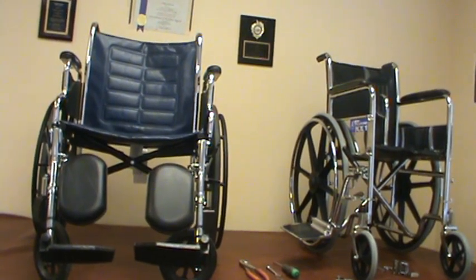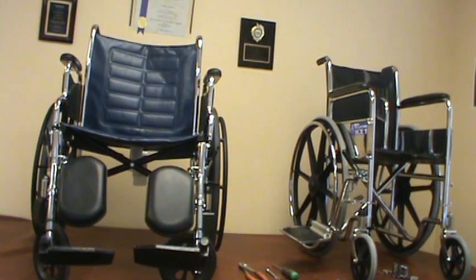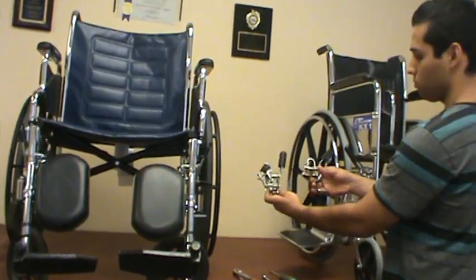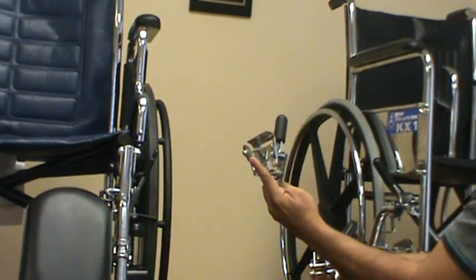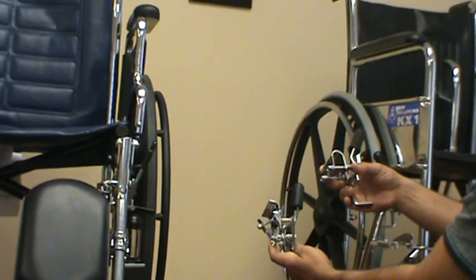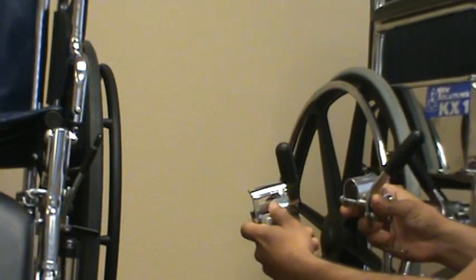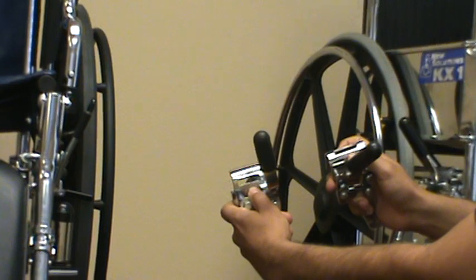This video will show you how to install and adjust wheel locks on a standard manual wheelchair. There are two different types of wheel locks: one is a bolt-through InvoCare style and the other is an over-the-bar clamp ENJ style. They both have calibration marks to help you adjust and see where you're at — in eighth-inch increments.